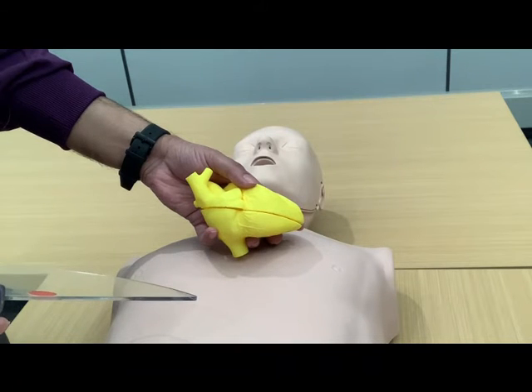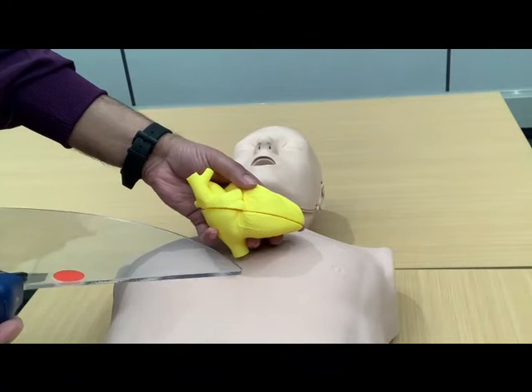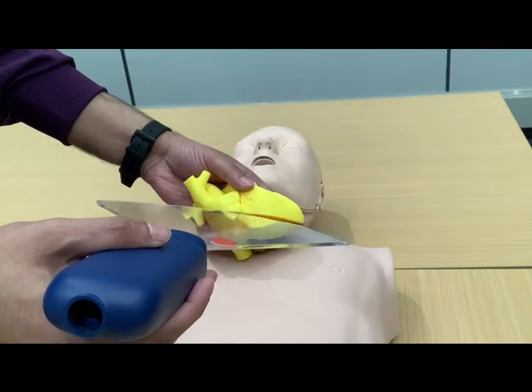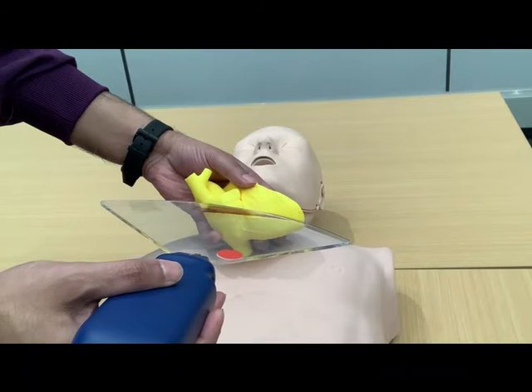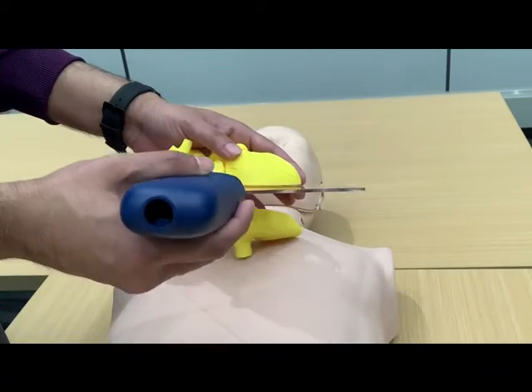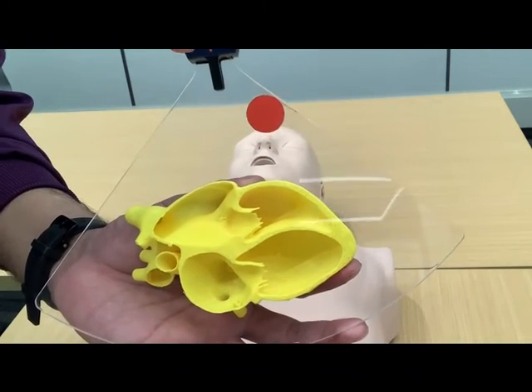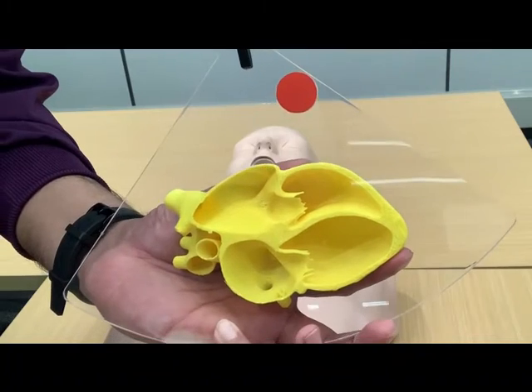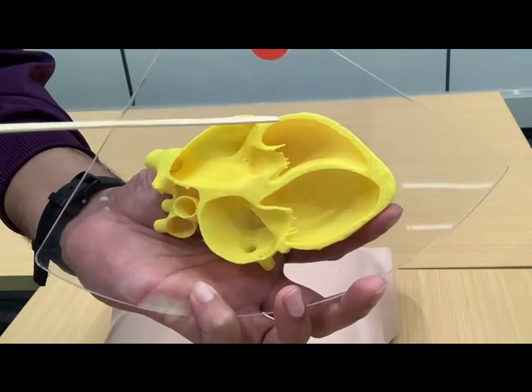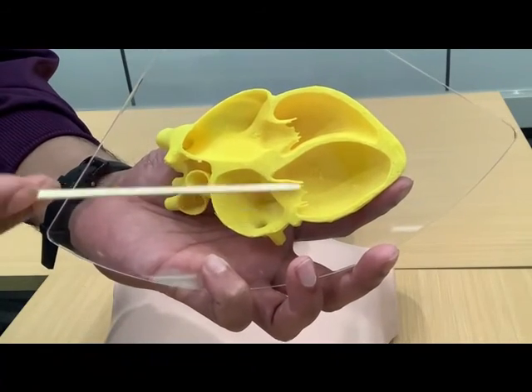Now let's get the subxiphoid four chamber view of the heart. This is also a coronal slice of the heart, but instead of placing the transducer at the cardiac apex, you slice the heart from the abdomen — from the xiphoid window. When the beam goes from the abdomen into the chest, you angle the transducer slightly upwards towards the patient's head, and the beam slices the heart. The first structure the beam contacts is the liver, so you see the liver on top of the image. The image is very similar to the apical four chamber view but is a tilted version. Structures closer to the liver are right-sided chambers: the right ventricle, right atrium, and tricuspid valve. On the other side are the left ventricle, left atrium, and mitral valve.